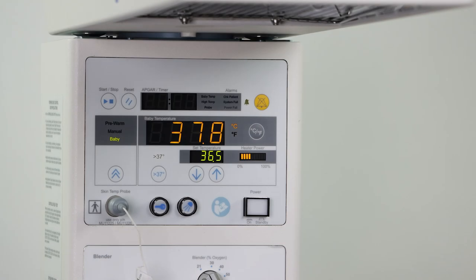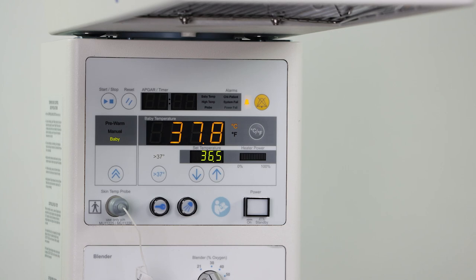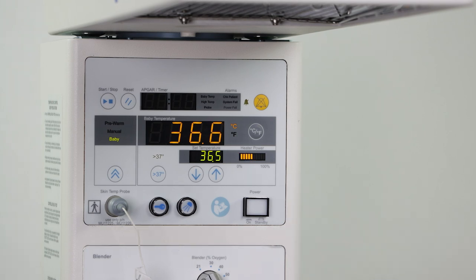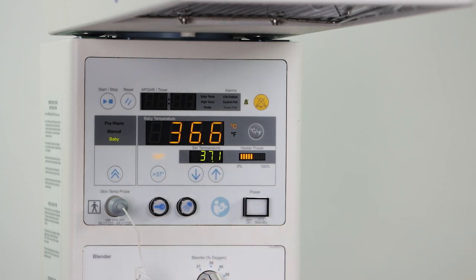During operation of the device, there are several alarms that can occur, which will be displayed during operation. With the available alarm silence feature, the alarm can be silenced for a period of time. The controller will display the neonate's temperature in the larger LED display. The smaller temperature displayed shows what the set temperature is. The 37 degrees Celsius override feature allows for a device temperature above 37 degrees Celsius up to 38 degrees.